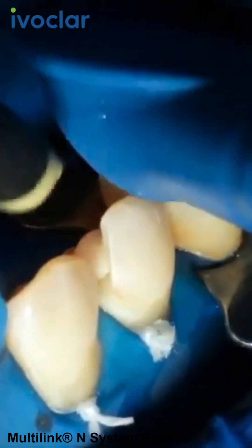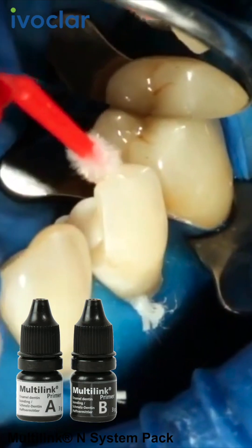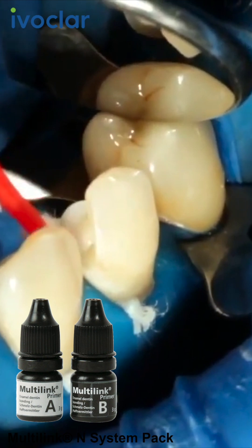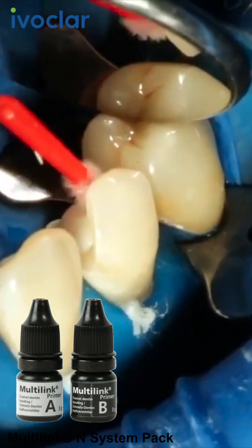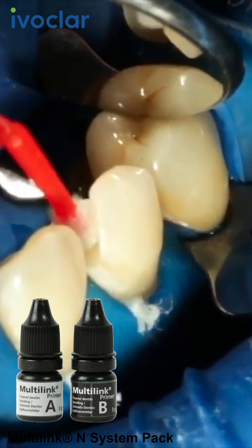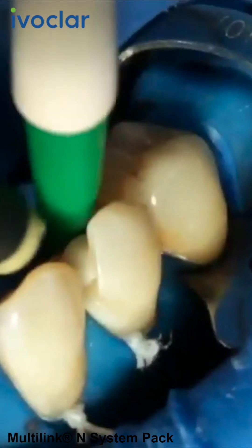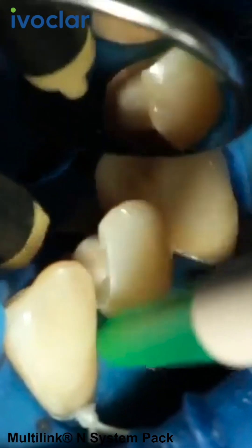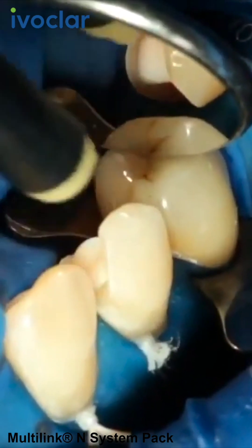Apply the Multilink N Primer onto the entire bonding surface using a microbrush and scrub it for 30 seconds. Start with the enameled surface. Disperse excess Multilink N Primer with a stream of air until the mobile film disappears. The primer is self-curing and no light curing is required.